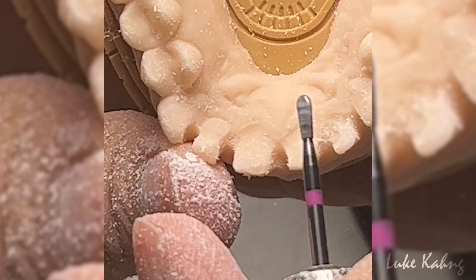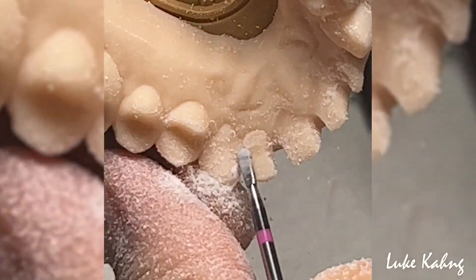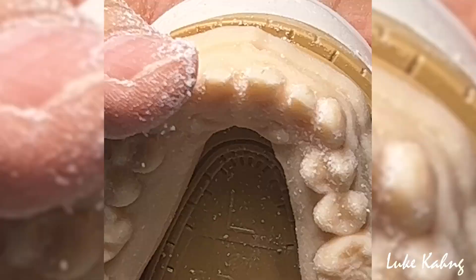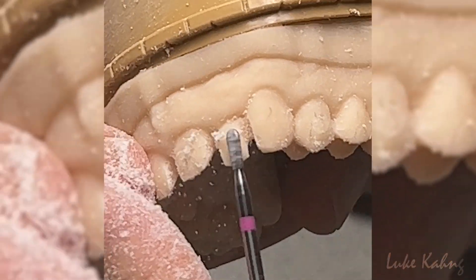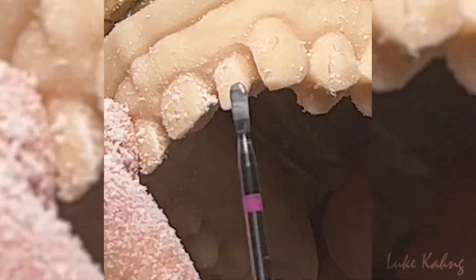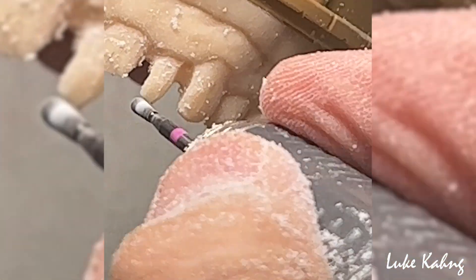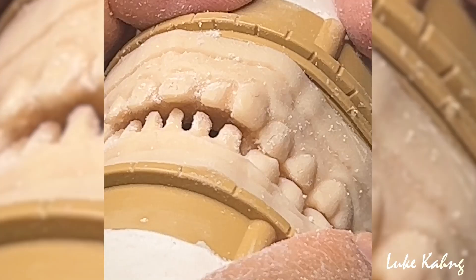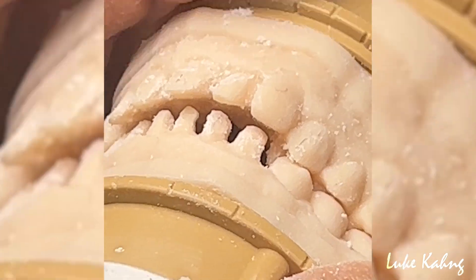There's a little bit thick here. I can trim this. So I got good alignment, good alignment. And facial — I trim it. Too long, then cut it. So check the occlusion — pretty good. That's my goal.